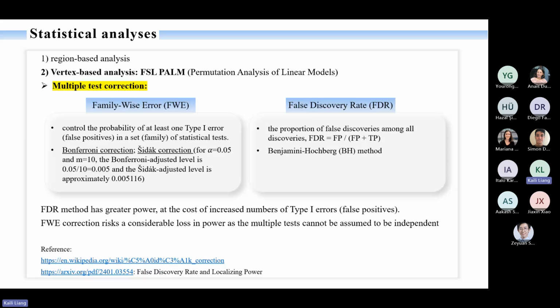Yeah, but I think here for FWE, it's set for clusters. We have different clusters, it's like a cluster test. Otherwise you never reach significance. A Bonferroni correction would divide by the number of vertices times the number of contrasts times the number of hemispheres. Yeah, I do that.